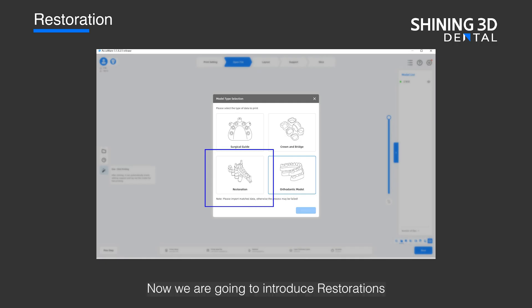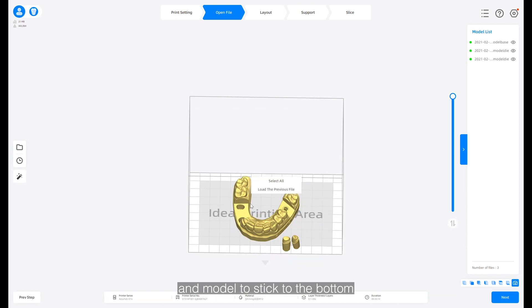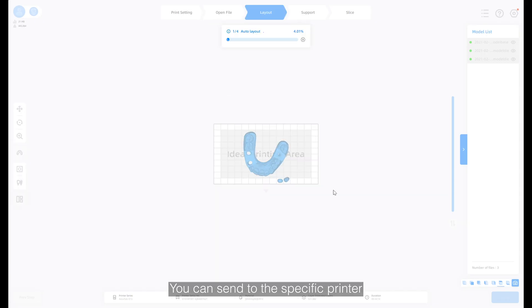Now we are going to introduce restoration. AccuWare will automatically recognize the dies to add support and model to stick to the bottom. You can send to the specific printer you want to send.